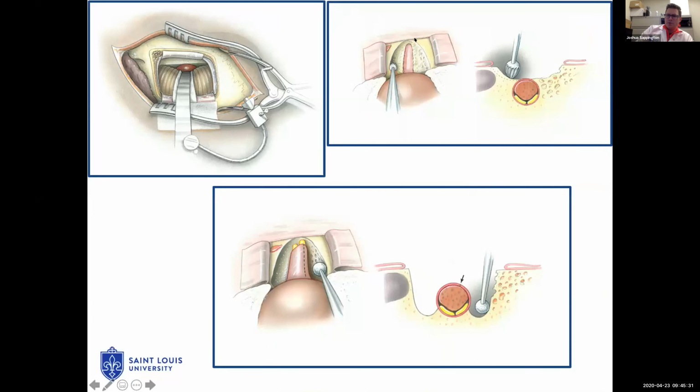And this really illustrates the part that you can get to internal auditory canal extension with a retrosig. It just depends how much extension you have. I think we can all look at this picture and say if the tumor stopped here versus going distal to this area, well, that makes a very big difference. And it makes a difference with your hearing preservation.